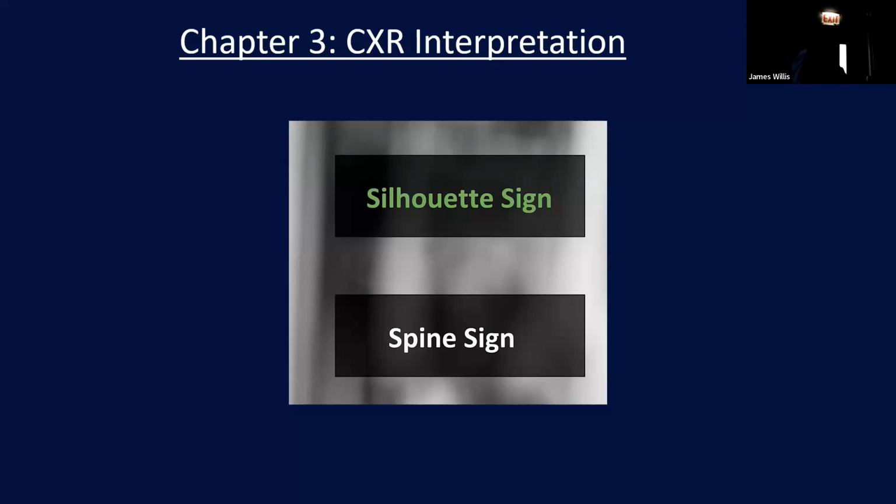So once again, it's a clinical diagnosis. If we don't see the presence of anything on a chest X-ray, that doesn't necessarily rule out the diagnosis of pneumonia. We're still going to treat our 81-year-old female accordingly, just off of the physical examination. But this is a good time just to bring that up. Once again, the chest X-ray is not the end-all be-all for pneumonia.